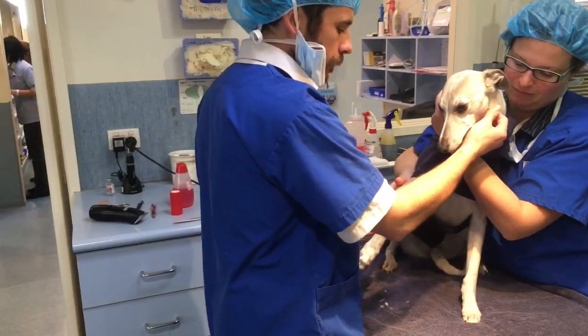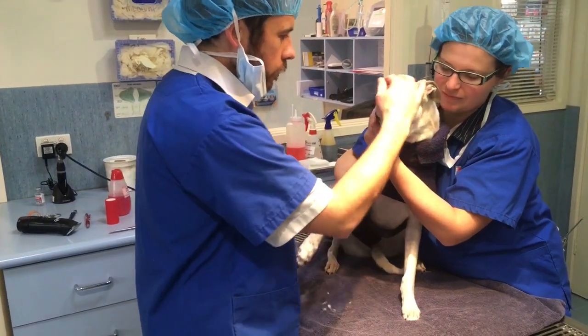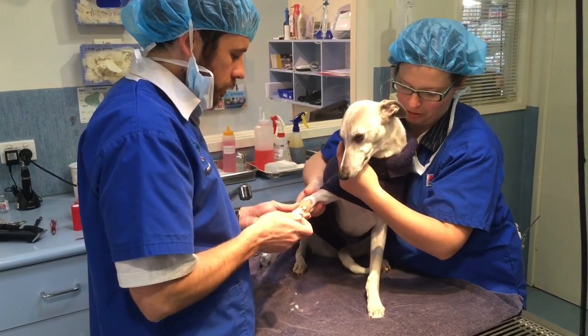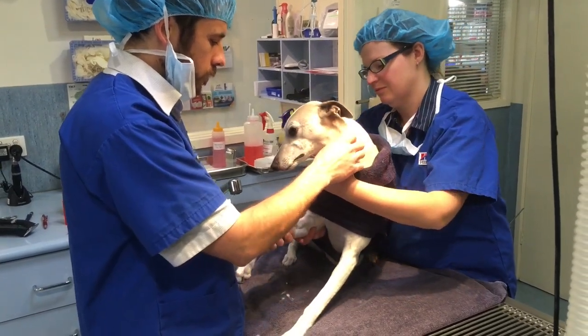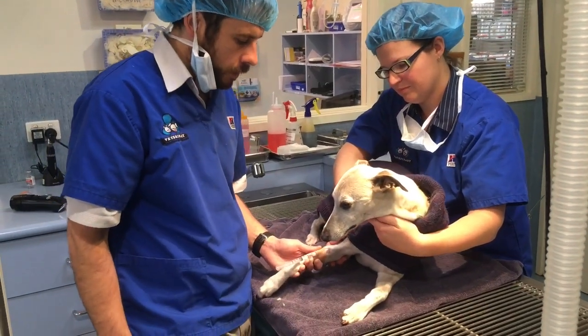Rosie will just start getting sleepy. It's the first time I've knocked you out, isn't it? Christina has done you before, but this is the first time I've knocked you out. Sometimes they feel a bit disoriented as they're going down under the anaesthetic.